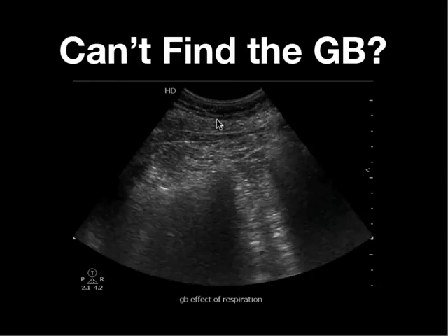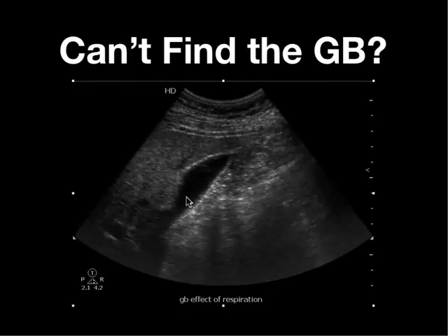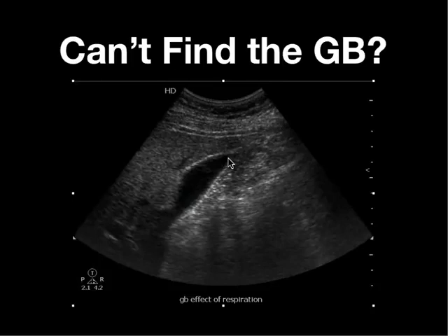What if you're scanning and you can't find the gallbladder? You're as close to the costal margin as possible and all you see is dirty shadowing from bowel gas. What you should do is have the patient take in a deep breath. Now you can see the liver and the gallbladder. Remember, anything close to the diaphragm is going to be affected by respiration, and having the patient take in a deep breath will help you in visualizing the gallbladder.